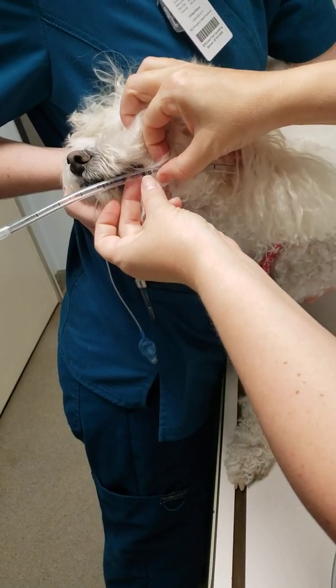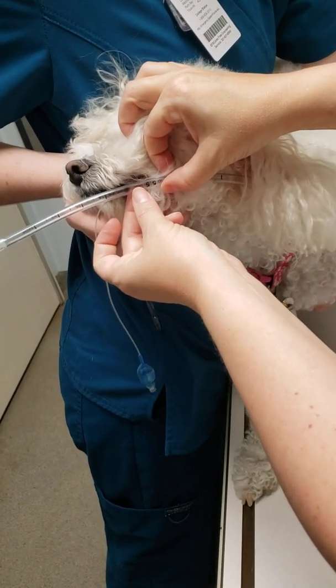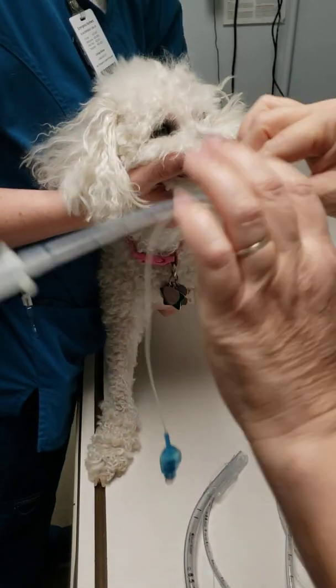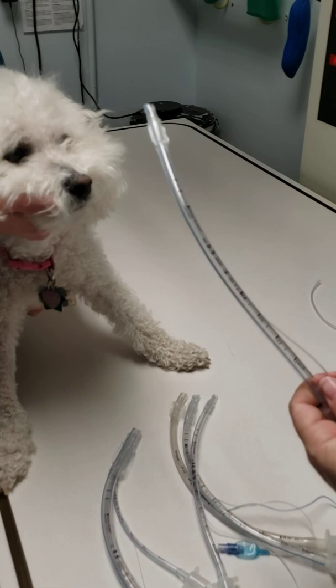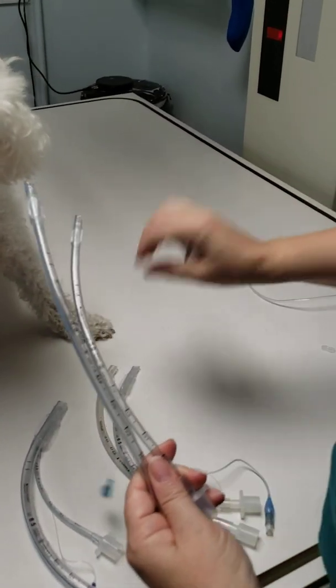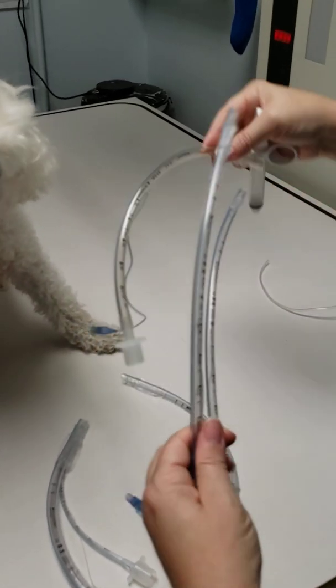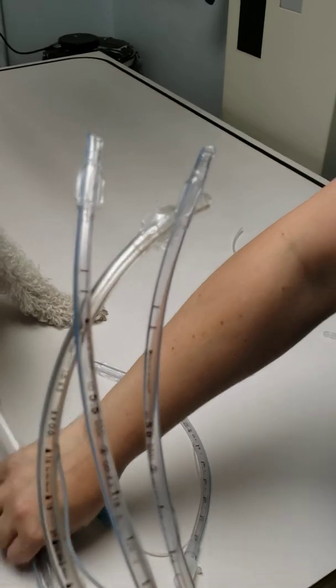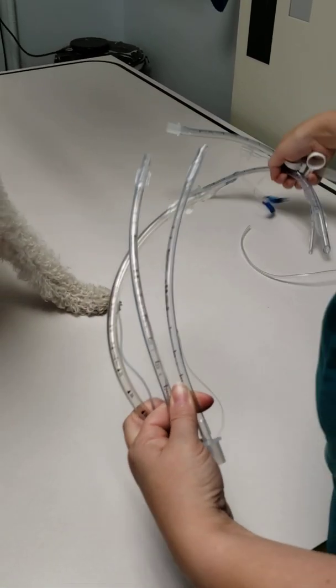In my case, a five and a half size tube, and you're going to have the tie right where it says 'oral nasal.' Once you've figured out which tube size you need, you're going to have a half size above and a half size below — so I have my five and my six — because you never know until you actually get in there.